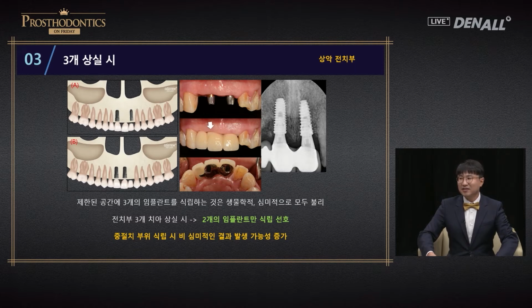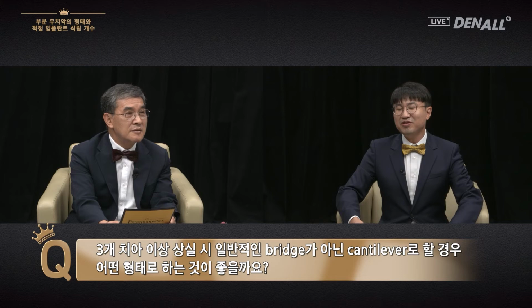at all times. I can see that you have used a cantilever. In the anterior area, I believe that it's okay to use a cantilever. However, in the posterior area, if you don't use a bridge, and if implants are placed more on one side, if you do a cantilever at that time, I believe there are many things that we need to be aware of. I believe you should avoid cantilever in the posterior area if possible.